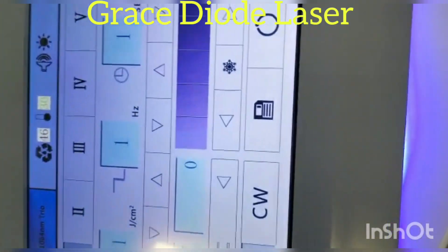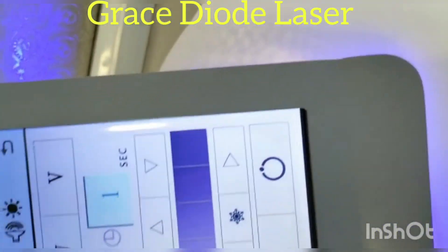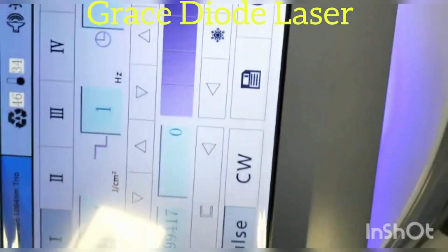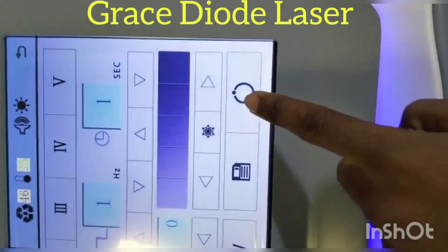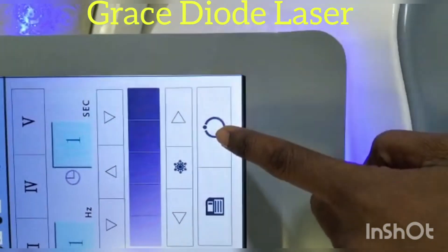This is an energy calculation, frequency and time. This is a mode — pulse mode and continuous mode. This is ready and standby. You can also increase and decrease.